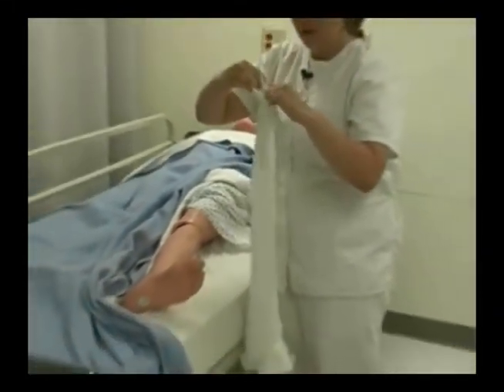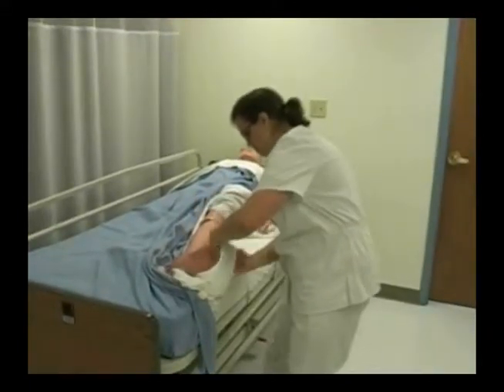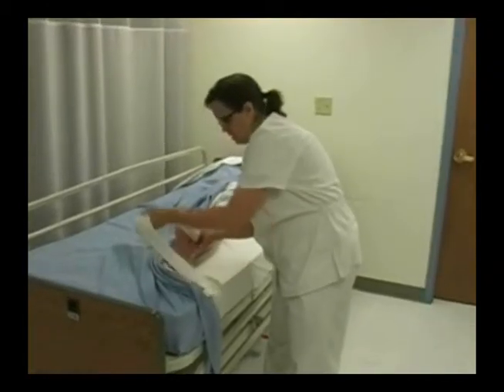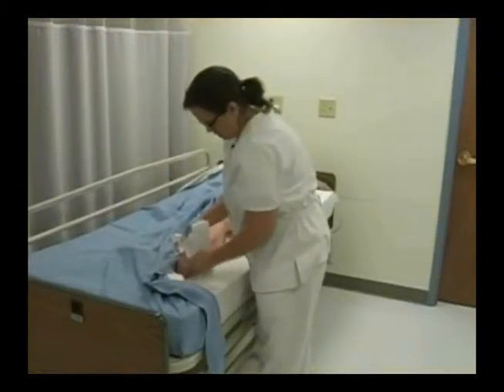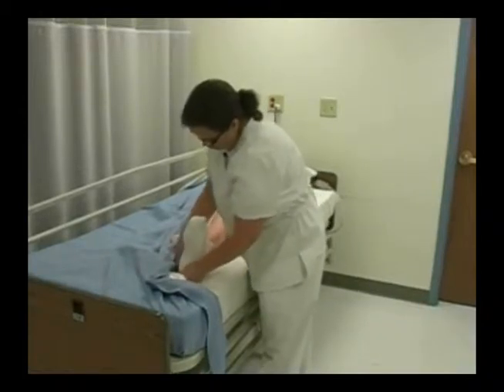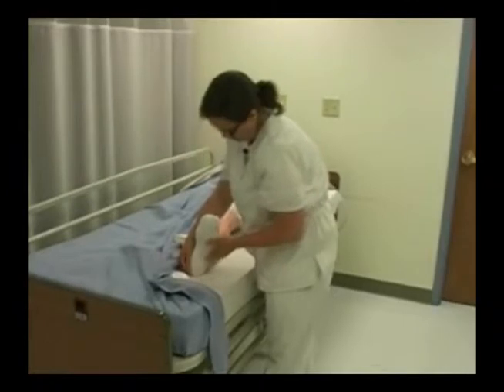Don't let go of the heel pocket. Position the stocking over the patient's toes. I want to make sure I know where that heel is supposed to be going, and I'm going to pull the entire stocking over the patient's whole foot and over their heel as well.